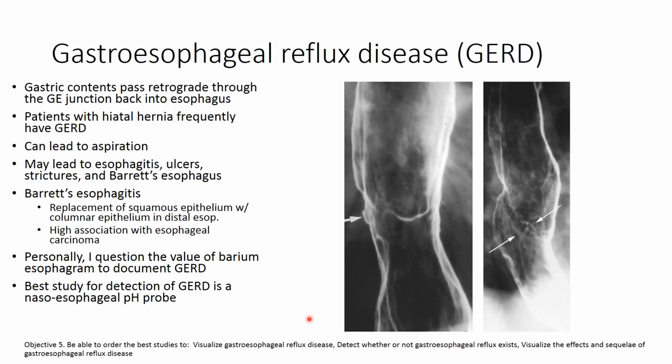Patients don't like barium. They tend to gag and kind of spit it up, and this may present gastroesophageal reflux that they wouldn't otherwise have in their day-to-day life. So I'm just not sure how useful this is.